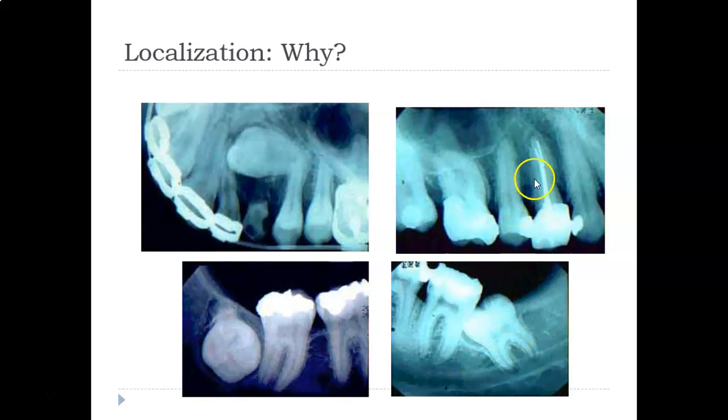And then up here, we can see that this premolar is bifurcated. It has two roots. When an endodontist is doing a root canal, they can't just say this is a one-root premolar, when in fact it could have multiple canals, and you have to get all the canals, or else you're not going to get rid of the infection, and they'll keep having problems and need a retreat.